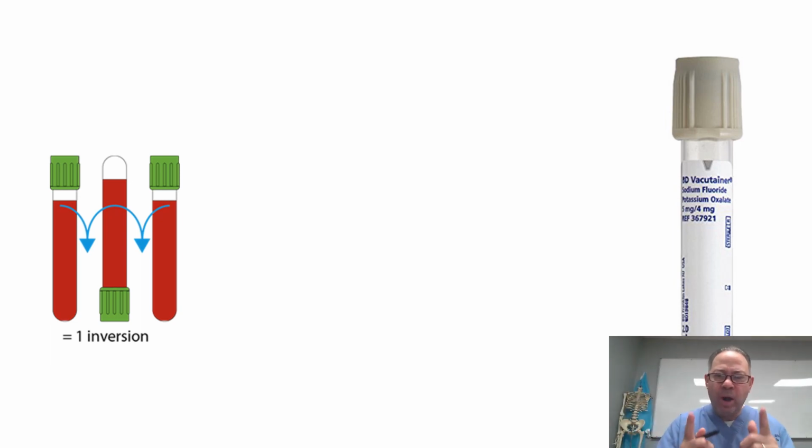If I want to know if my patient is diabetic, I need to obtain the blood in a gray top tube. I cannot take the blood with syringe. Why not? Because the syringe has nothing inside to prevent glycolysis.